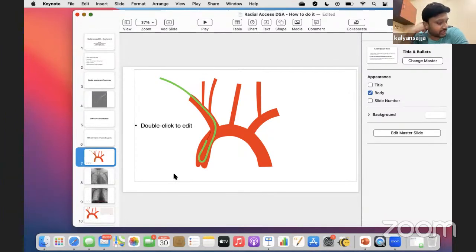You talked about left vert shaping. You talked about the SIM shaping can also be done in the vert, actually. You can shape it in the vert and then twist it into a figure of 8 and push it down so that it goes into the arch. Yes. And then you can just do right common, left common runs and finish the DSA. Carotid shaping, I talked about that.